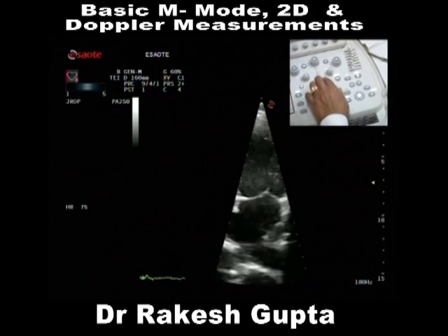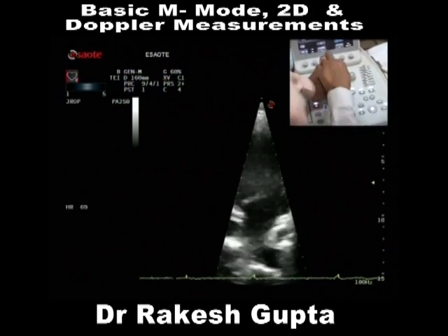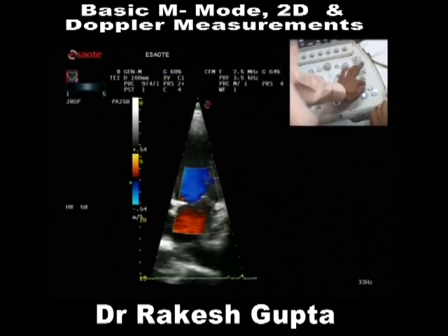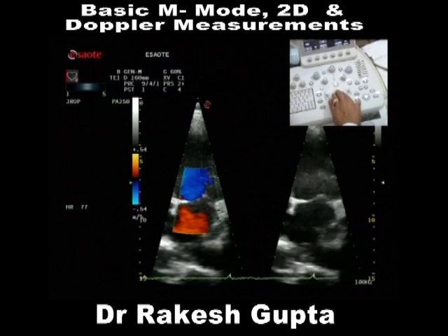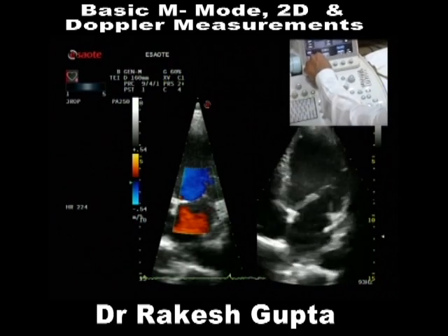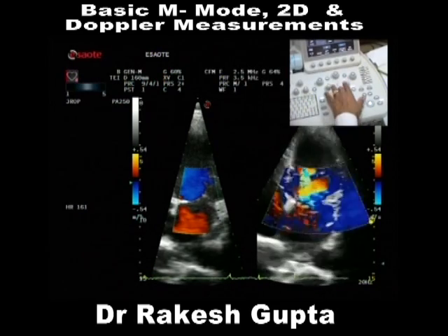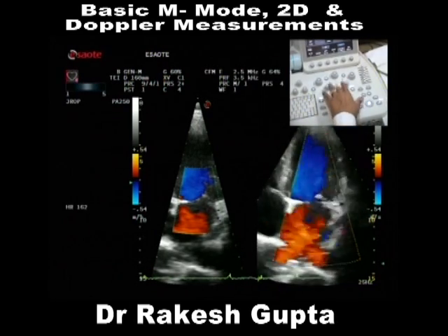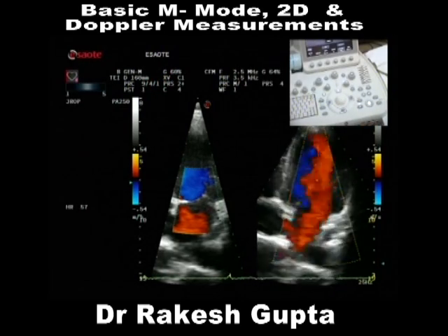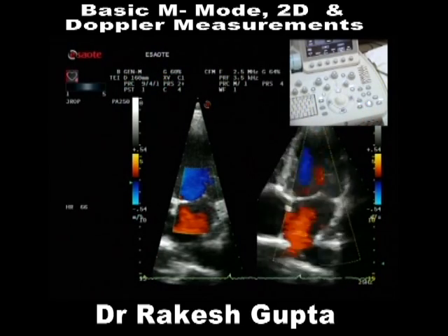Same patient, now go to the second screen. Now on the same patient, first of all I am increasing my size, second I am increasing my box, now I am acquiring a clip, and my young friend will play both the clips together. Show both clips.